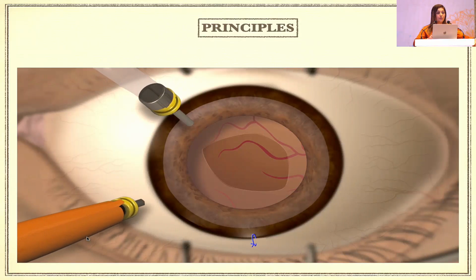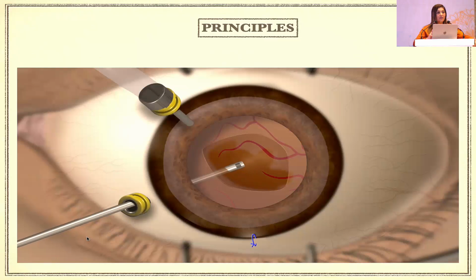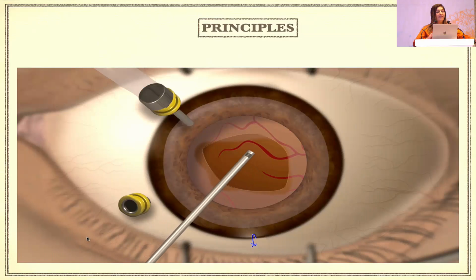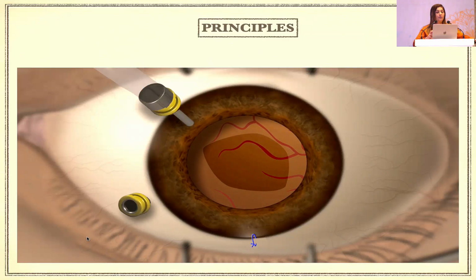You can also use an anterior chamber maintainer at this point of time, but you need to make a posterior entry and do a pars plana vitrectomy. The ideal thing is to place a trocar, shave off the vitreous that is bulging into the anterior chamber, and then the limited amount which is there in the periphery, you can clear by doing a limbal approach from the limbal incision. So maybe you can use a combined approach out here.